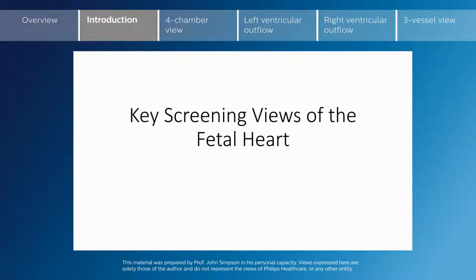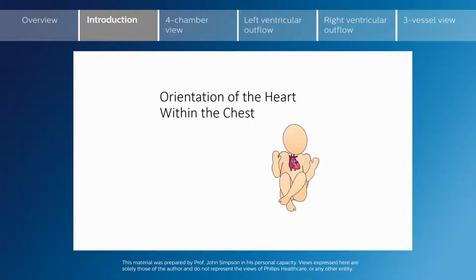By way of introduction, I'm going to show a short PowerPoint of the key screening views of the fetal heart. And as part of that, it's really important that we understand the orientation of the heart within the chest. Here is just a diagrammatic representation of baby with a heart as shown.